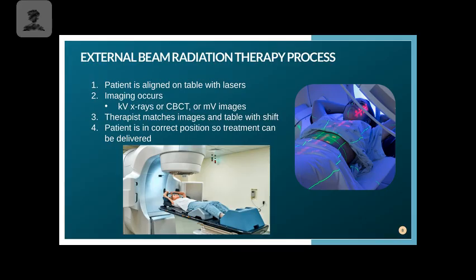Other things, if you were just curious about on the skin here, this patient has this red line and little numbers on there. So that's actually a ruler, and it's a distance indicator from our gantry head. So that's very similar to when you're thinking about your SSD, or your source to skin distance in X-ray. That'd be if you took a tape measure and measured from the source, which would be the anode, down to the patient's skin. This thing happens in our linear accelerator, but we don't have to use a tape measure. It just shines it on the patient. And actually, there is some fancy X-ray equipment out there that does do that. It shines down a measurement label.